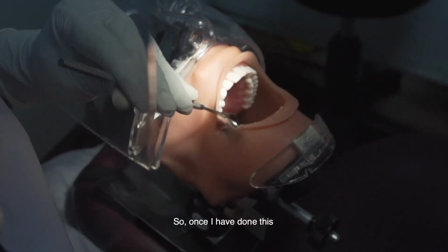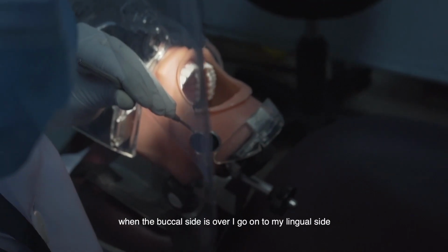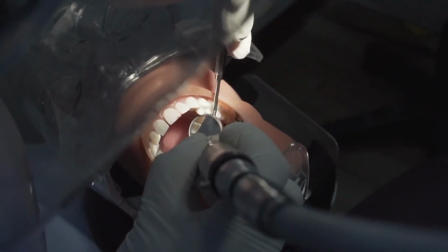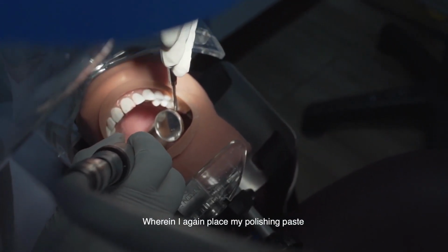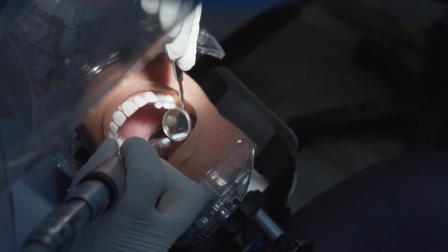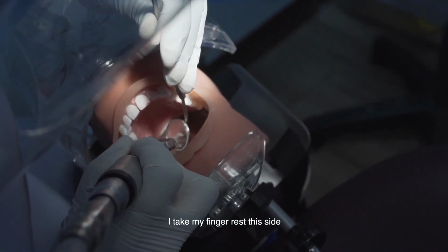Once the buccal side is over, I go on to my lingual side, wherein I again place my polishing paste. I take a finger rest on this side.